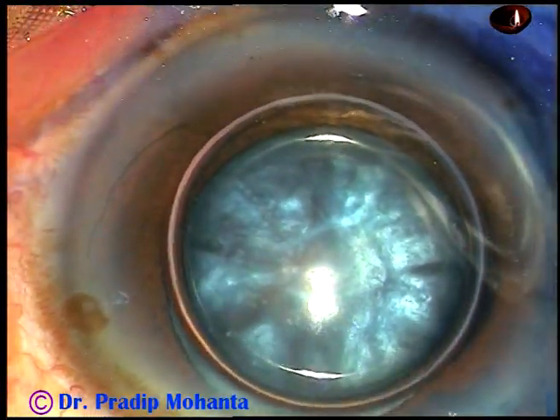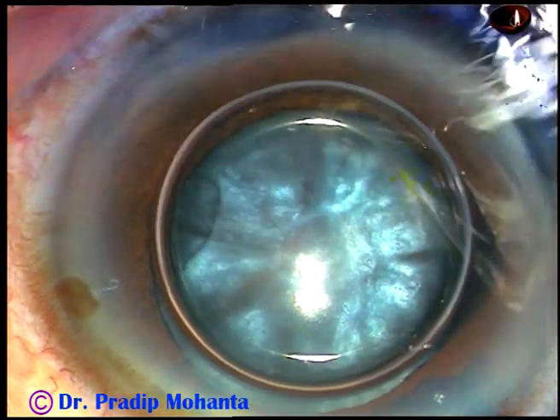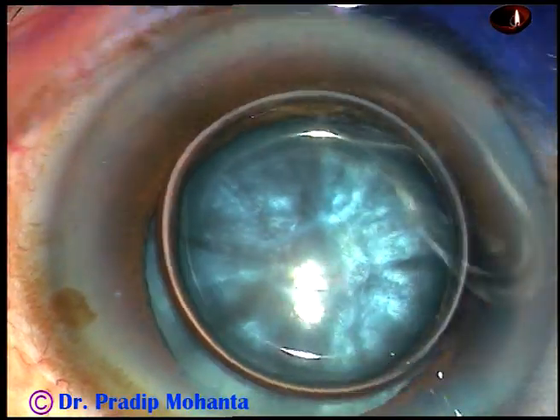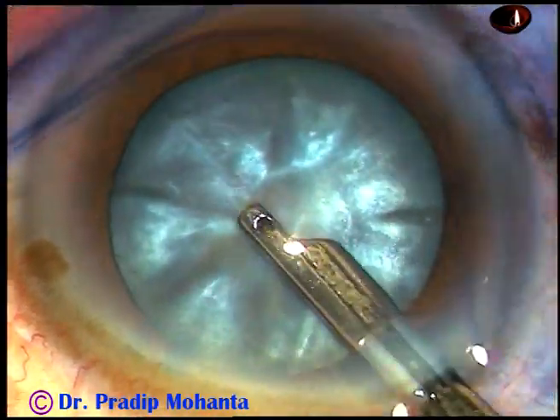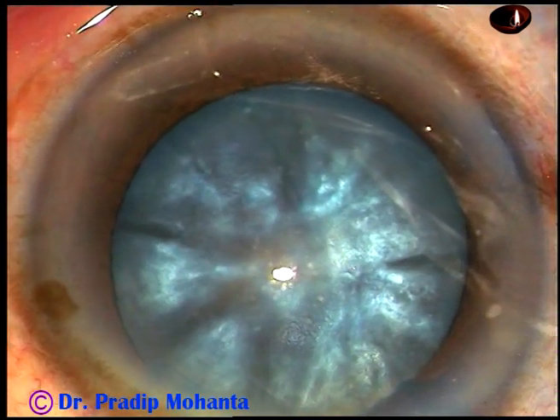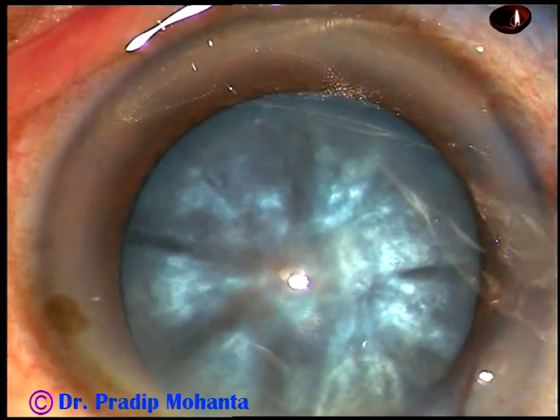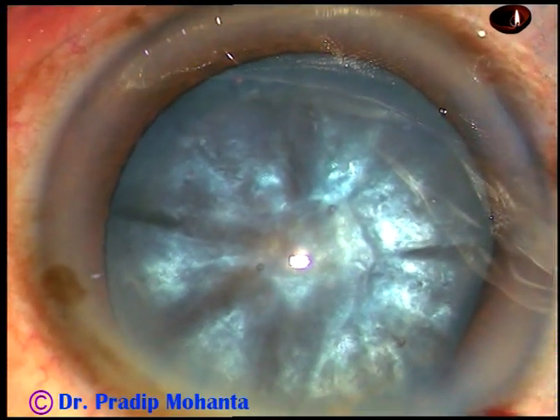And now this is a bit of adrenaline. Now the dye is washed out with BSS. And then in this case, I am going to use 2% hydroxypropylmethylcellulose as the viscoelastic substance. And this is the viscoelastic substance.